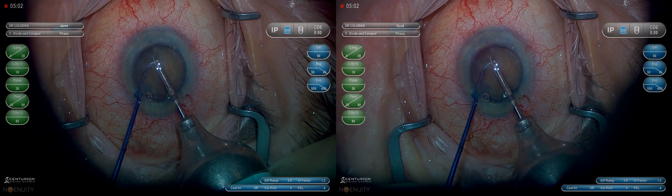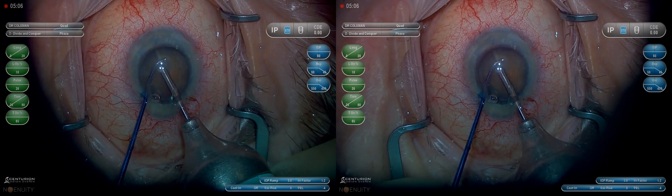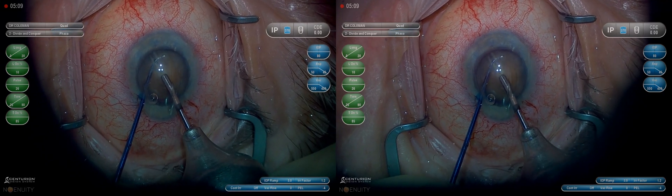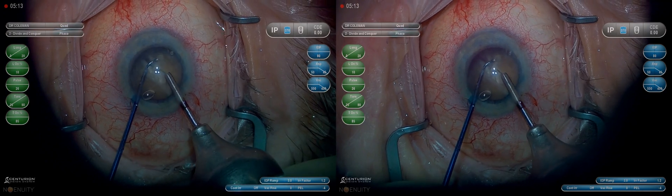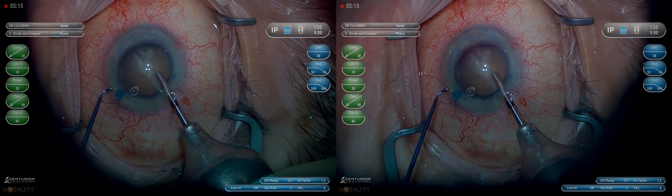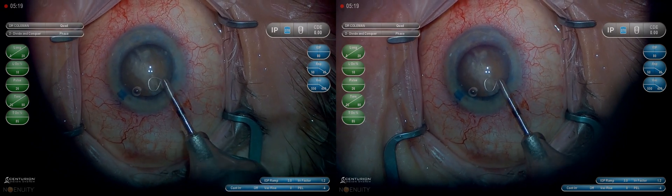We have to hold the lens down with our second instrument as the MyLoop cuts through the nucleus, to keep it from pulling into the anterior chamber. You can see we got a clean slice of a very dense cataract, and we completely pull the loop in to remove it from the eye.